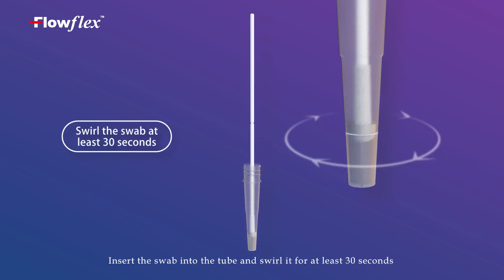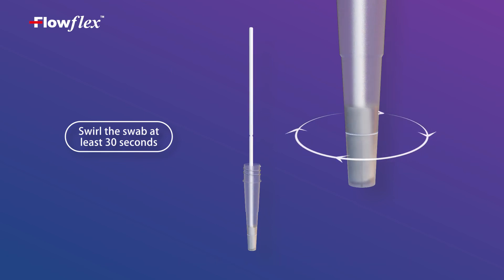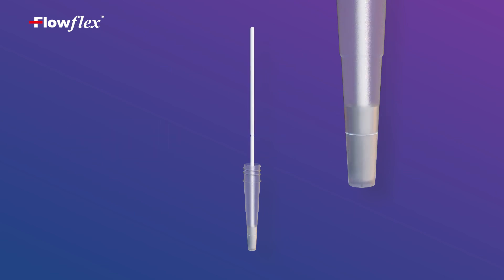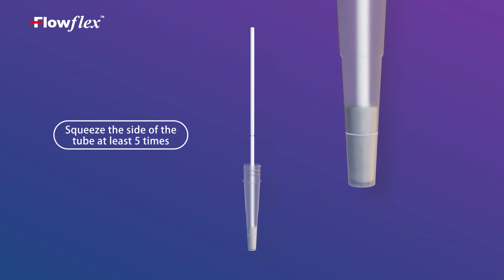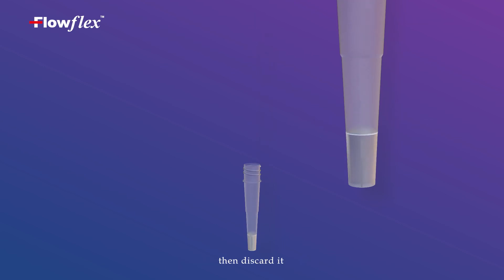Insert the swab into the tube and swirl it for at least 30 seconds. Then squeeze the swab against the side of the tube and rotate it at least 5 times. Squeeze the tube and remove the swab, then discard it.